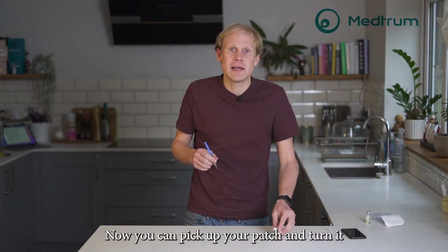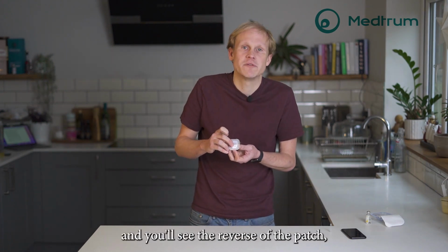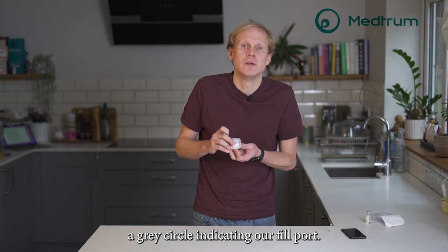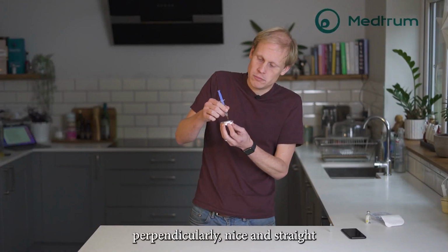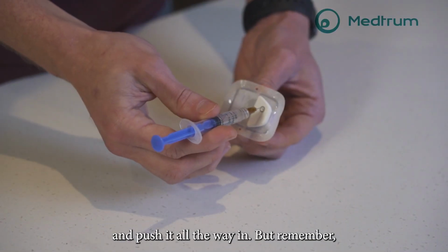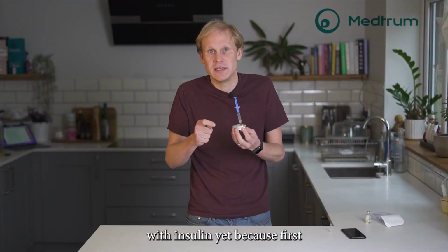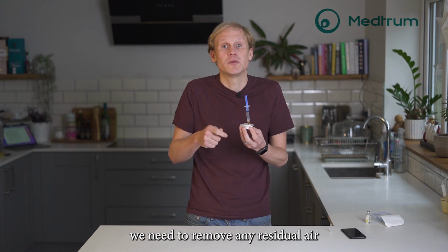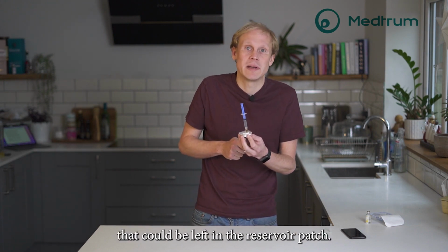Now you can pick up your patch and turn it the other way round, and you'll see on the reverse of the patch a grey circle indicating our fill port. We insert our needle into the fill port perpendicularly, nice and straight, and push it all the way in. But remember, we're not going to fill the patch with insulin yet, because first we need to remove any residual air that could be left in the reservoir patch.